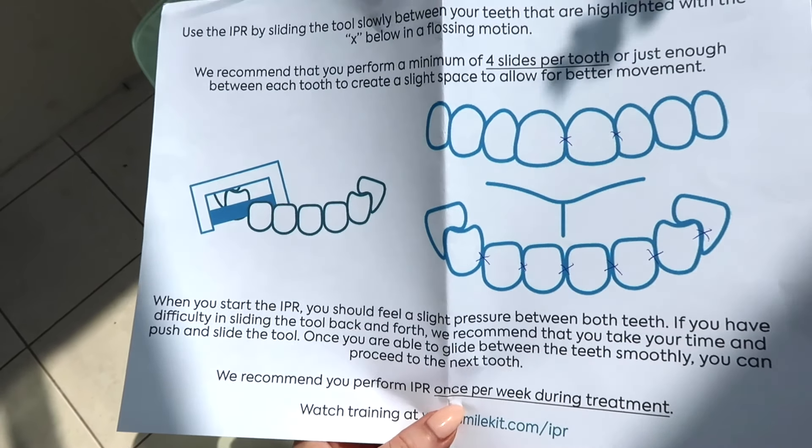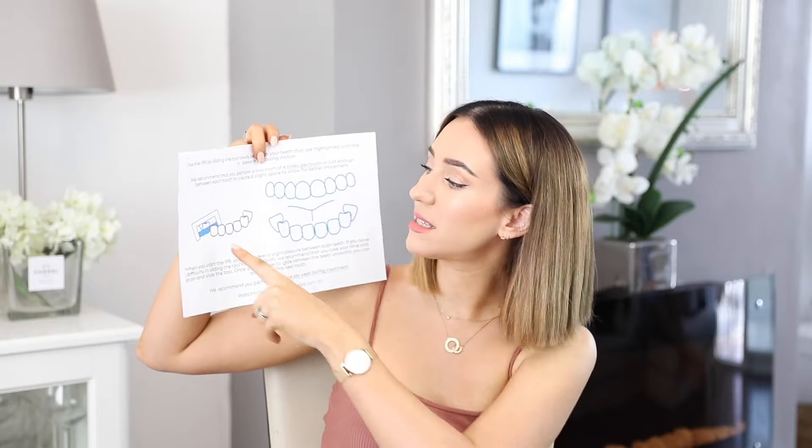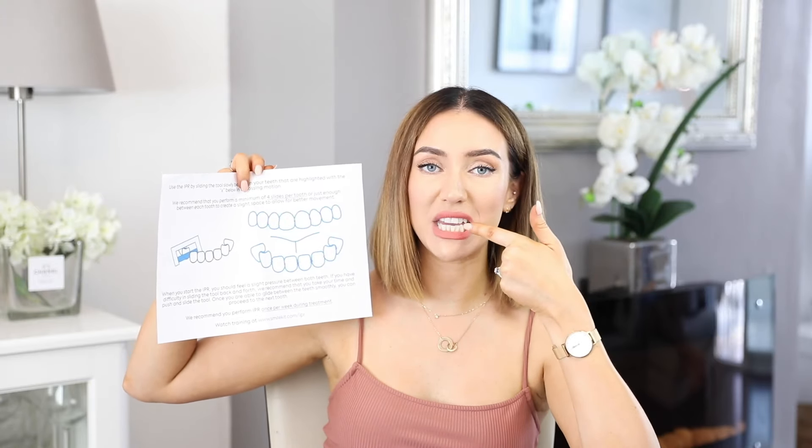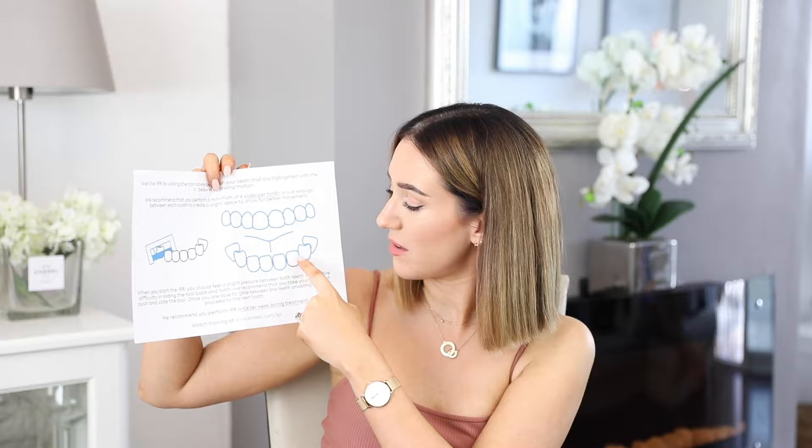There is also this tool here, which I don't think everybody gets - you get it if you've got overcrowding. It's a little tool that asks you to place it in between your teeth so that the teeth have got room to move. They've marked out which teeth they'd like me to do that on once a week, just to allow for better movement.